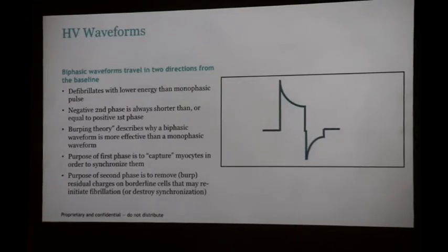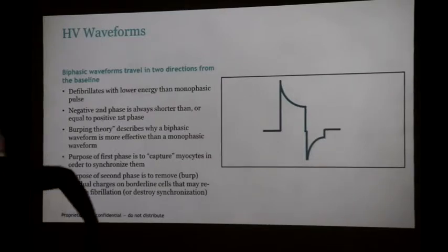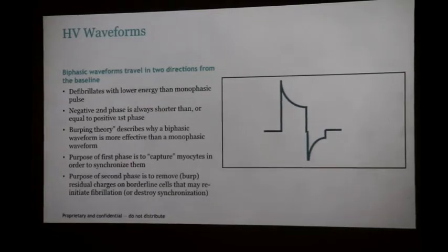Okay, but why? The subcutaneous array is an anterior structure? Yeah, that's why it's not good. It's here. Oh, you put it here. Okay. But someone punches you here, it breaks your subcutaneous array, right? Okay, but we have new subcutaneous ICDs.